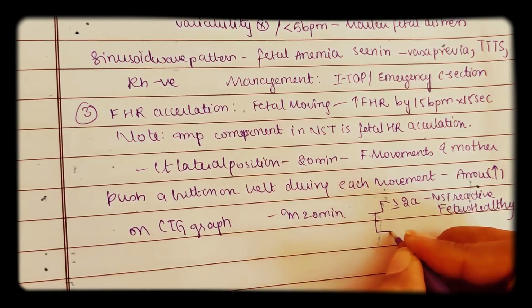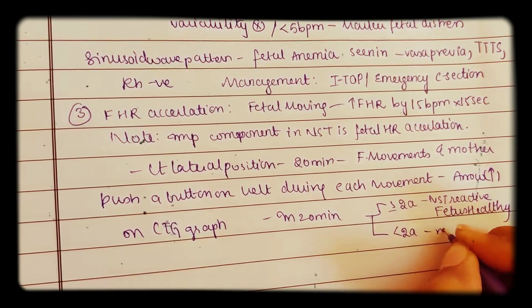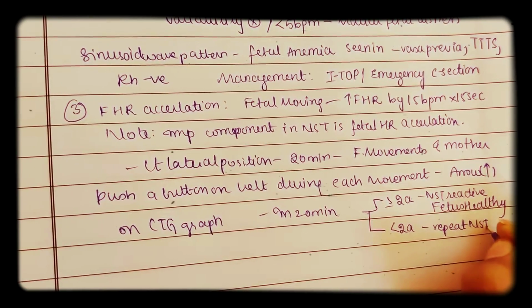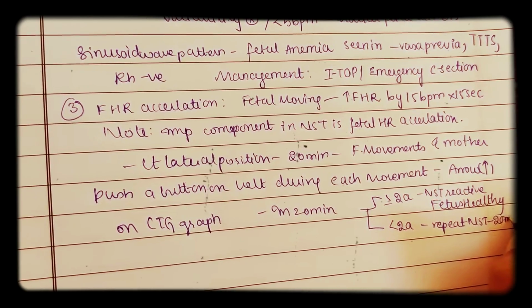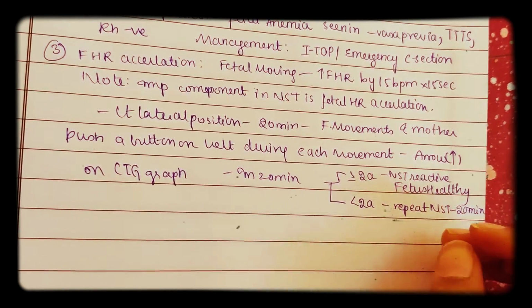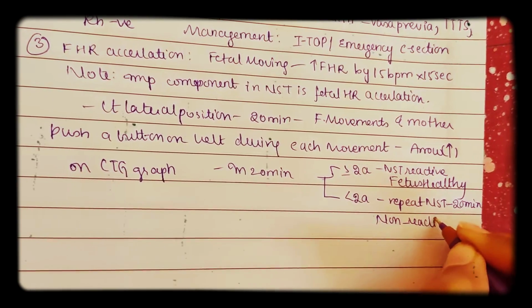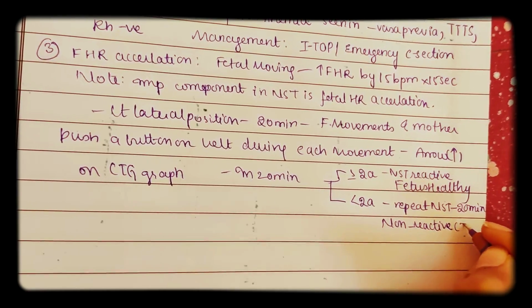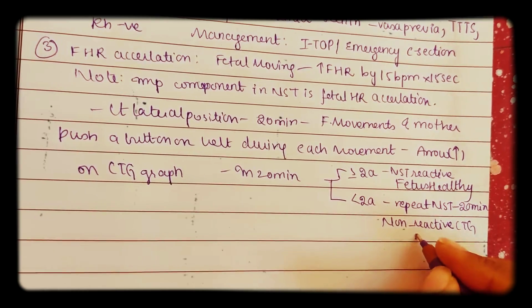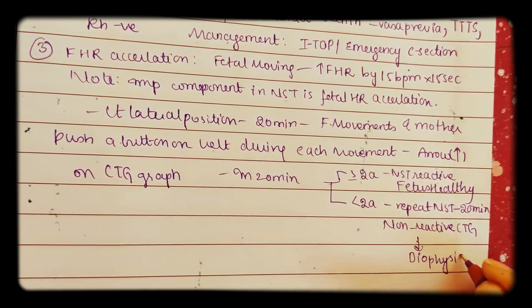Okay, and if the acceleration is less than 2 accelerations, then again we'll not directly say the fetus is not healthy, but we'll repeat the NST for another 20 minutes. That is, you can take this test for about 40 minutes, because 20 minutes before and 20 minutes now, right? So then you will say this is a non-reactive CTG. Even after another 20 minutes, if the NST is still not reactive, alright, next we will also go for a biophysical score to confirm this.